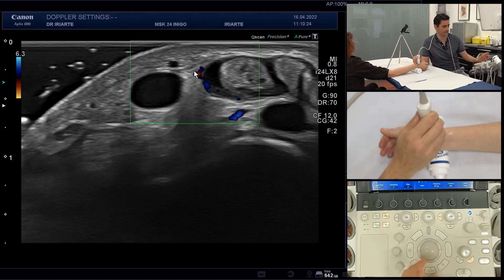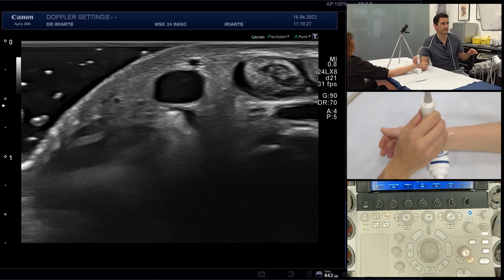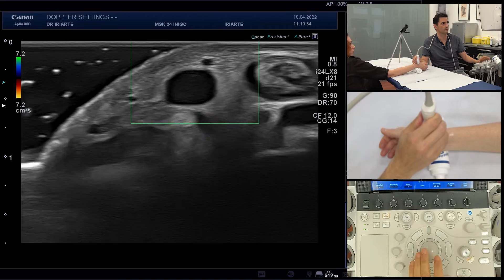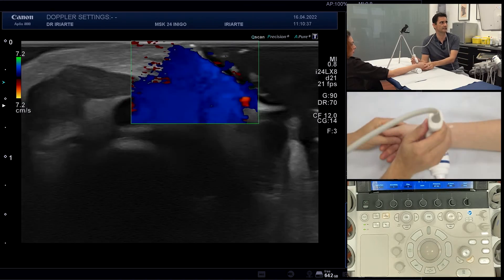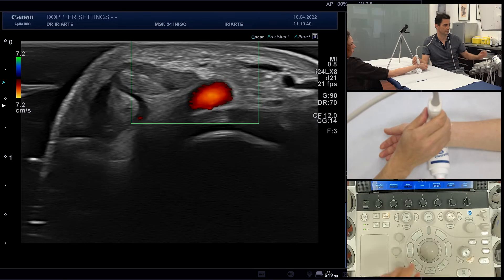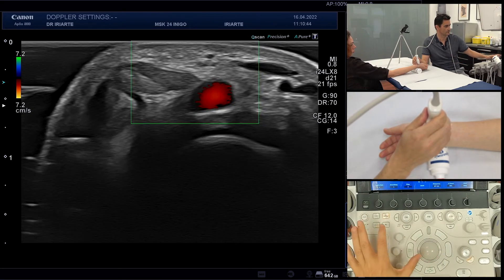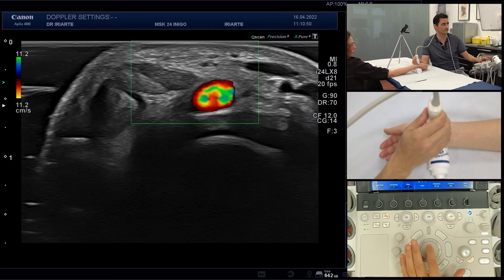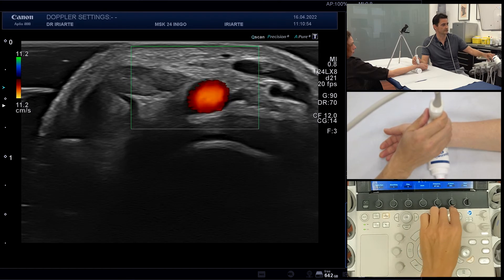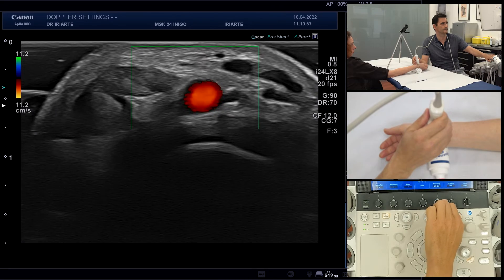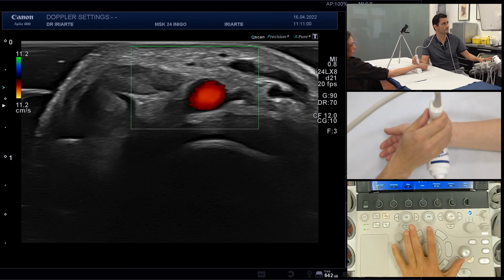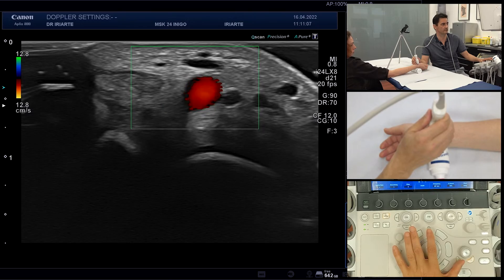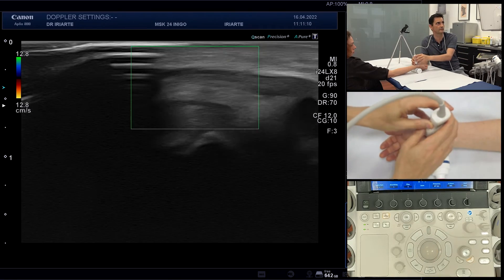The last thing I want to show you is the steering of the Doppler box. If we are in color Doppler and want to check, for example, the radial artery — we will increase the PRF a little because this is a faster flow, and decrease the gain. This gives us a quite good view of the Doppler inside the radial artery.